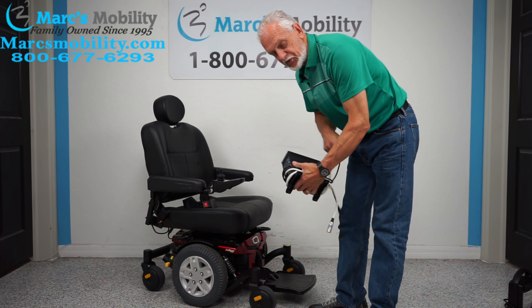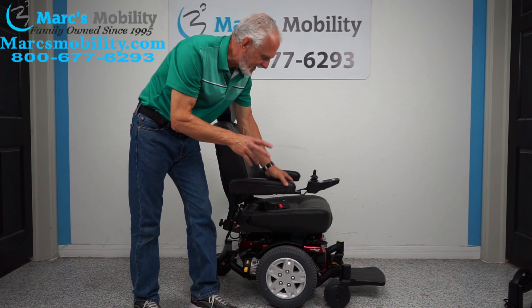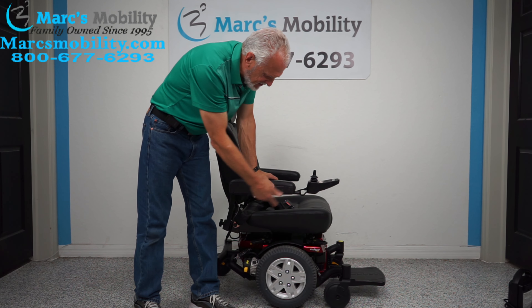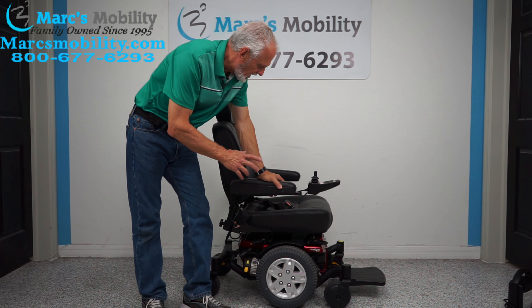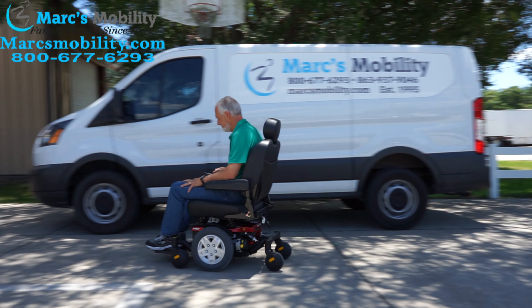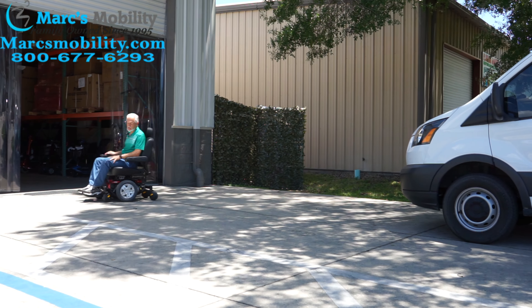So let's recap. We have here a Quantum Edge HD, practically new, used maybe two or three months. It has a 23 by 20 inch seat, flip-up arms, solid tires, HD suspension, HD motors, flip-down seat — just a heavy duty power chair. If you need a large seat and a basic heavy duty power chair, this one has a 450-pound weight capability. Top speed of this chair is about 4.5 miles an hour.